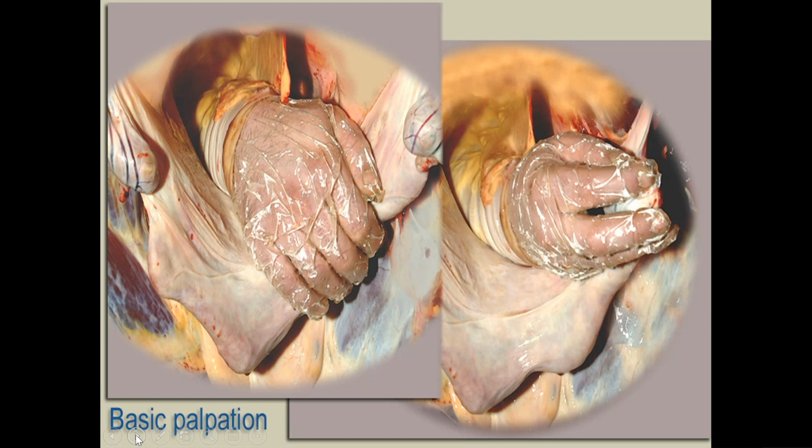The second reason is that certainly myself and I think most clinicians, as we're doing the rectal palpation, will make a decision about what it is we think we're feeling. Are we feeling a 35mm follicle? Are we thinking it's a corpus luteum? Are we detecting tone in the uterus? And obviously these palpation aspects of the examination aren't available simply from the ultrasound.